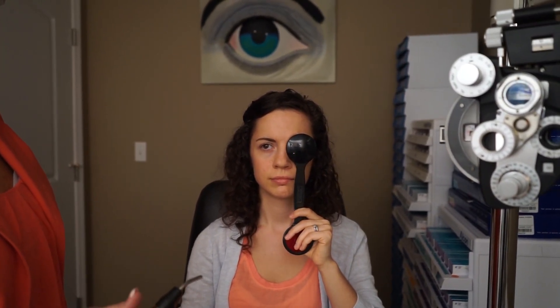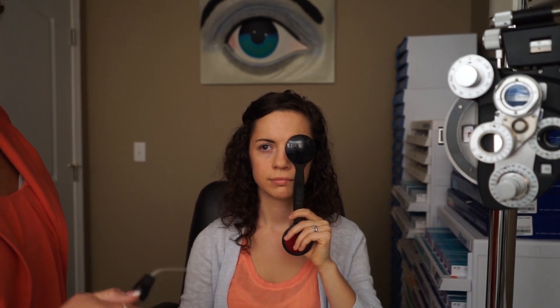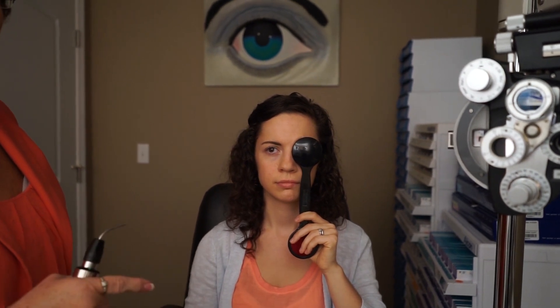If you show your light with the transilluminator and she cannot see it, then get your indirect ophthalmoscope out and try again. If she can't see the indirect ophthalmoscope light either, then you call it NLP — no light perception. But you do not call a patient NLP unless and until they cannot see the indirect ophthalmoscope light.